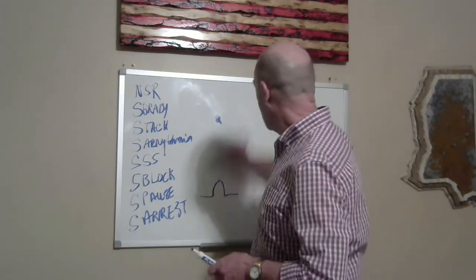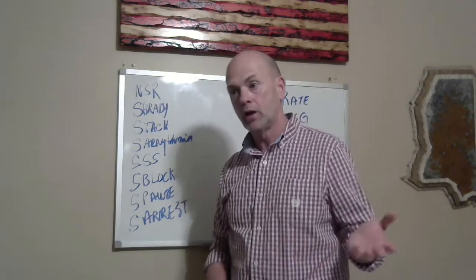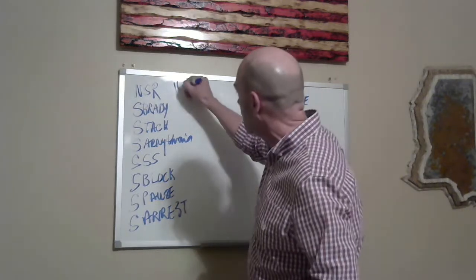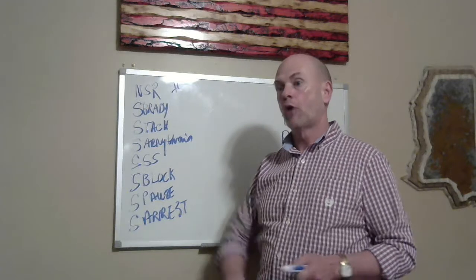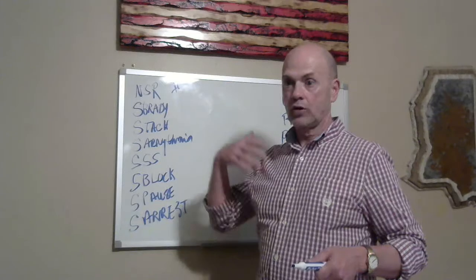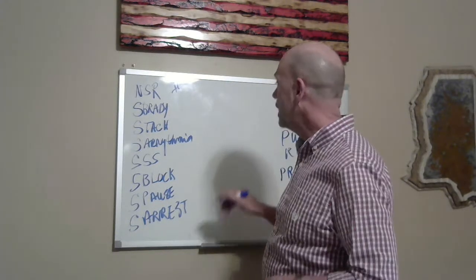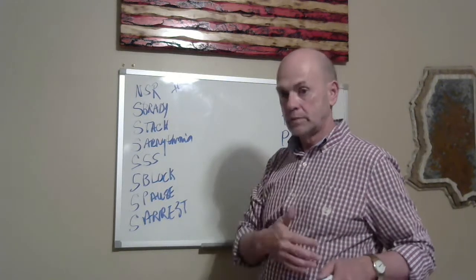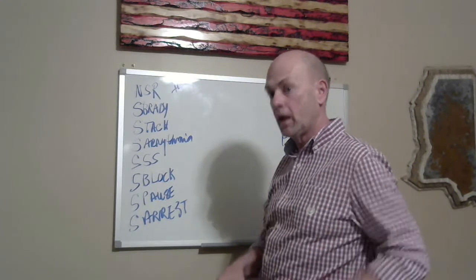So how do you determine which rhythm I'm looking at when I look at the EKG monitor? Lead 2. I'm looking at lead 2 because generally speaking on a normal heart we're going to see the greatest positive deflections as we move the electrical energy from the SA node toward that positive limb lead, left leg, because as we're moving from the right atrium, SA node, AV node, we're moving toward that positive electrode on that left leg.